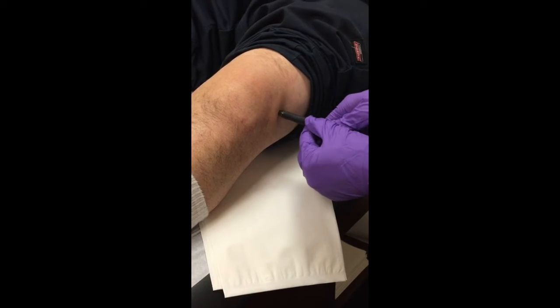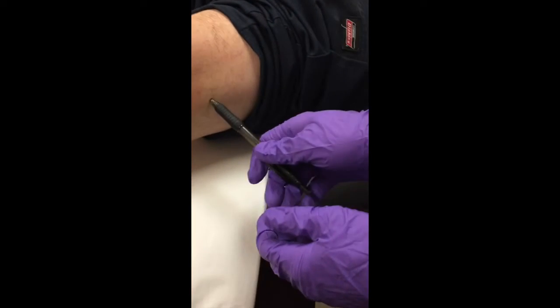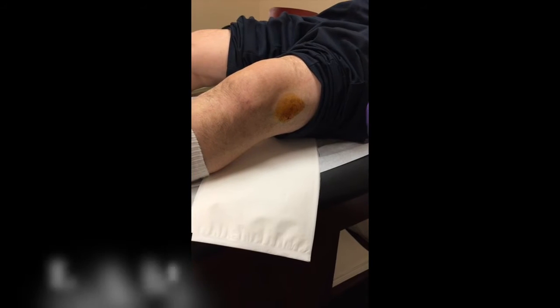You mark that spot with a pen like so, and then we wipe him down with alcohol and betadine. Now that we have him prepped up with alcohol and betadine, we're going to take our local anesthetic.